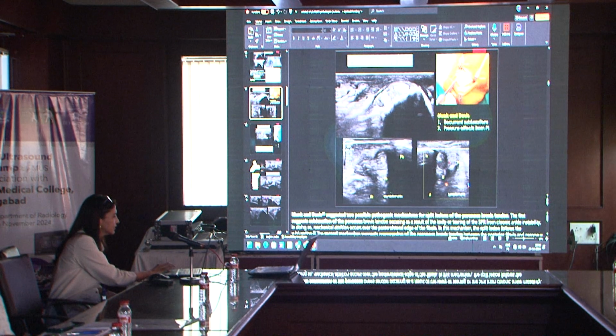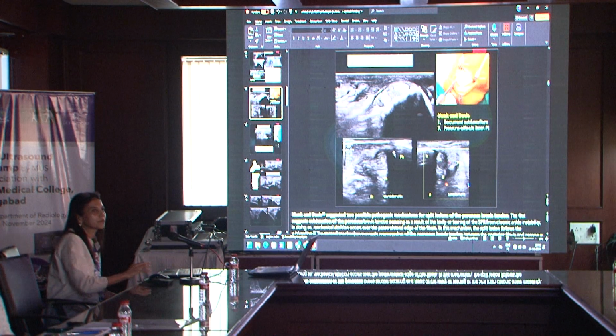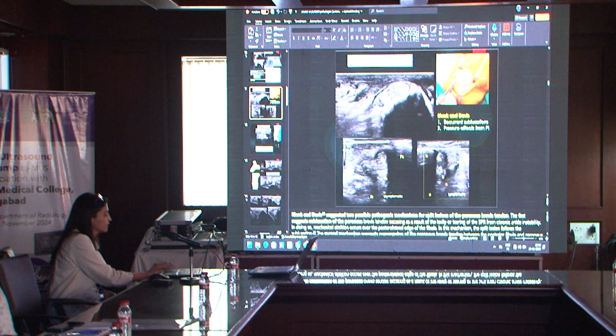What we see here is there should be only 2 tendons behind the lateral malleolus. Here we see that there are 3 components. Those are 2 brevis and 1 longus component in between. Here this is an asymptomatic side. As Dr. Gaurav said, we always compare with the asymptomatic side. Any abnormality we see on ultrasound, we compare it to the asymptomatic side. That's the lateral malleolus. We see 2 tendons. This is the symptomatic side. What we see is the longus tendon and 2 brevis tendons. So this is a longitudinal split tear of the brevis tendon.